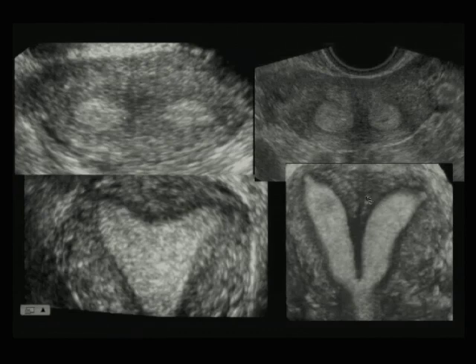On the other hand, this one has a deeply septate uterus. And you can actually see both horns quite nicely all the way to the interstitial portion of the tube. But you can see that this is a very deep septum. This is not a bicornuate uterus because there is no indentation at the top. There is just an indentation in the cavity.